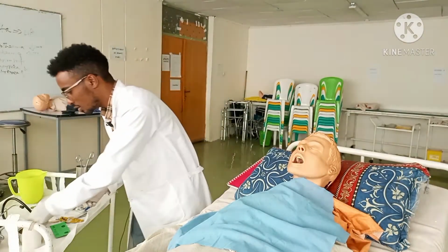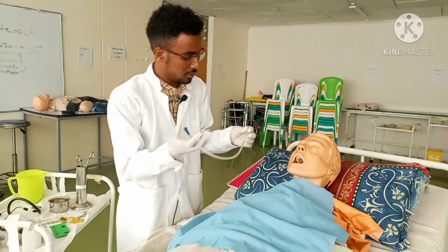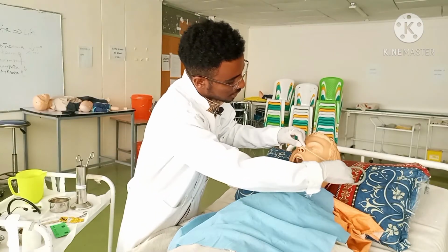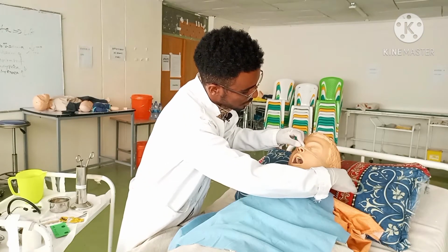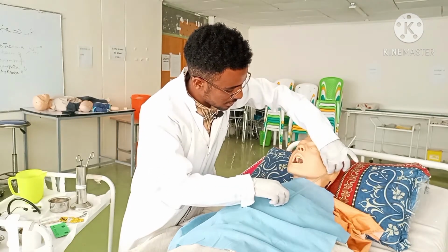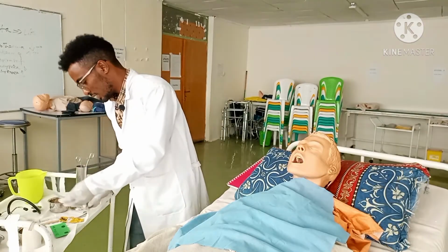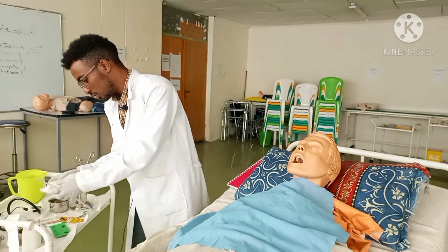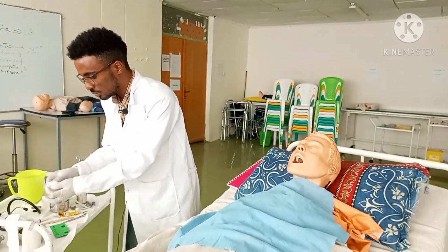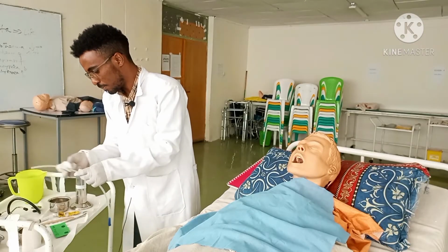Okay, next you have to measure the tube to be inserted. Measure the tube from the tip of the nose to the earlobe, then from the earlobe up to the xiphoid process. You have to put a mark here, then lubricate it with KY jelly. Don't forget to lubricate up to 6.5 inches of your nasogastric tube.